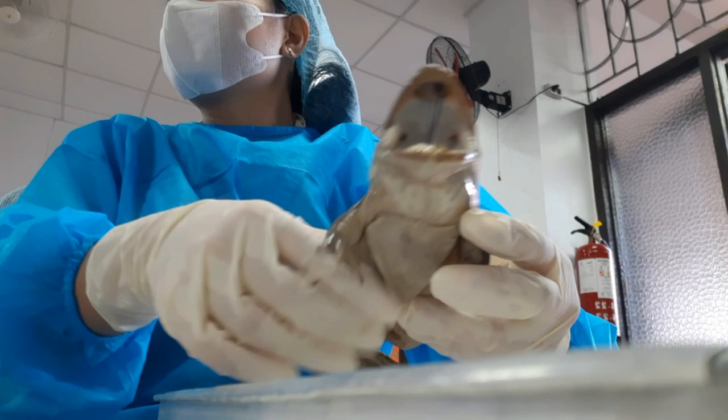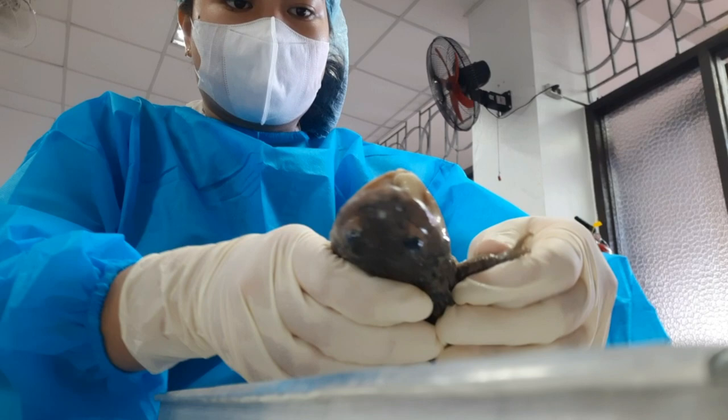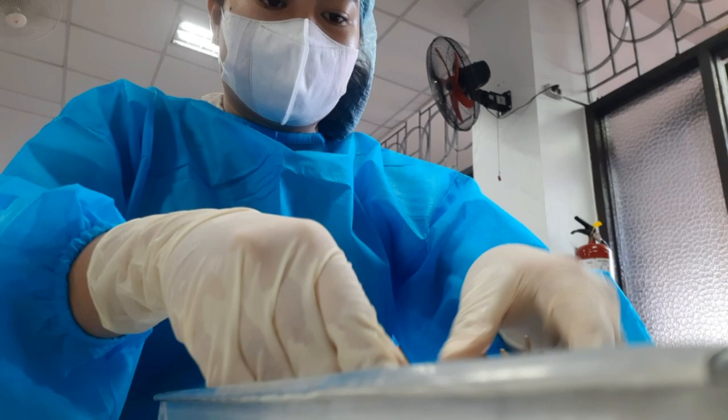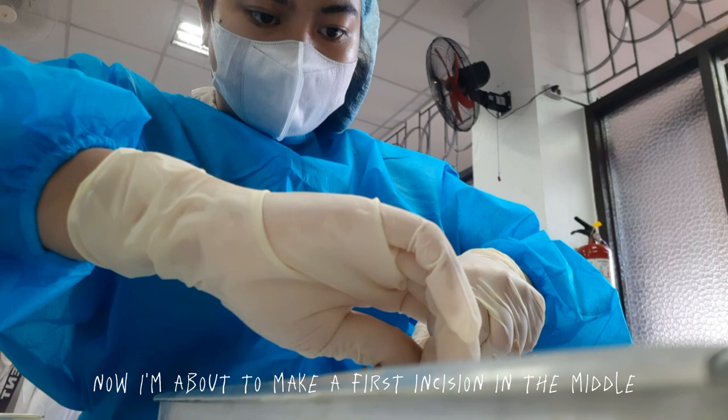Binatansikan ka pa kami. Dito? So, may mag-style ng card. So, from the upward sa anterior region, pataas na. So, make sure class na hindi yung mapahilalim masyado. Siya, layer lang tayo. Yung skin lang nito. So, pat natin siya towards the pataas na.